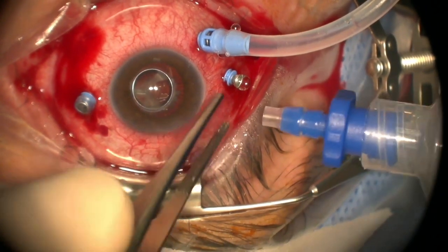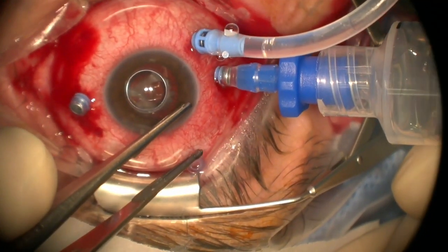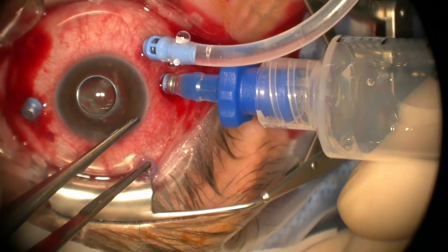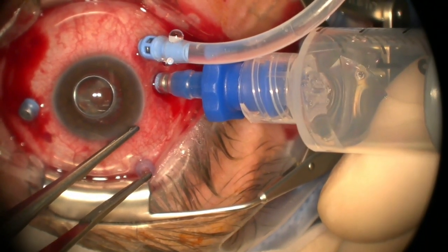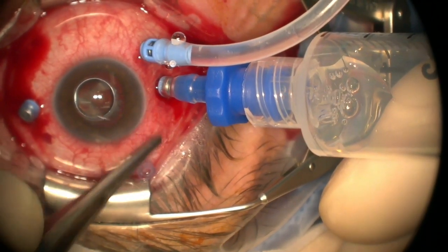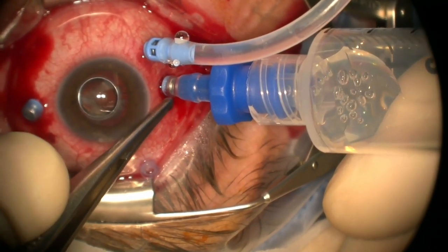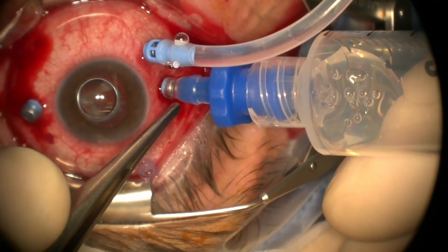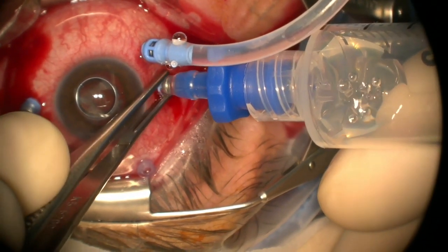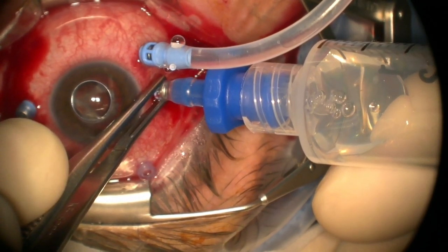You can see oil dressing there. Quite often we can get a little and I'll try and get an idea over here of how quick that's working for us. And I do think that's working quite a bit better. So the advantage being you don't put that metal cannula inside, which is a lumen inside of a lumen. Now we're using the full gauge of the 25 gauge cannula, let the oil come out. Anything that's thinner is going to slow down your egress of oil quite a bit. So the bigger the hole, the quicker the oil moves out. And that's what we're going for here.